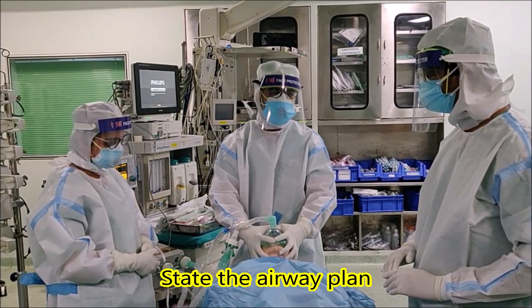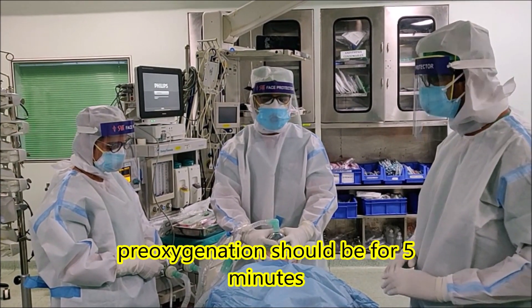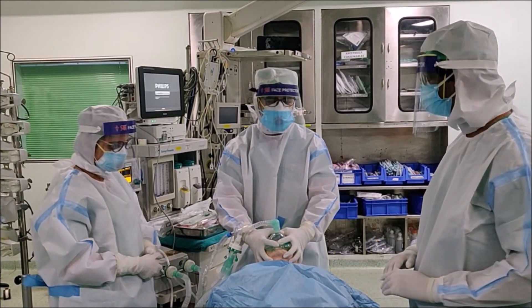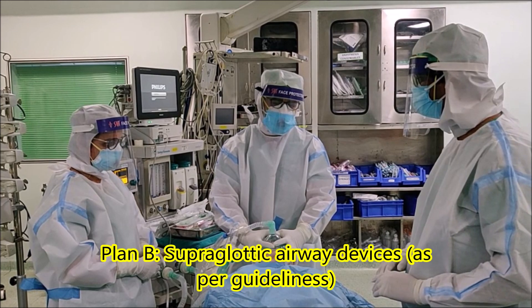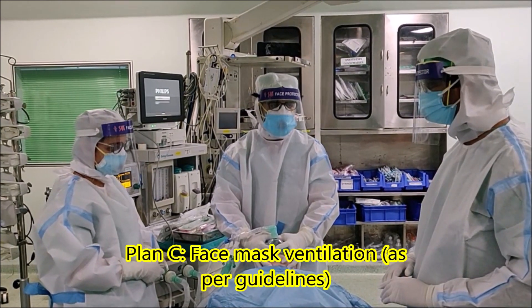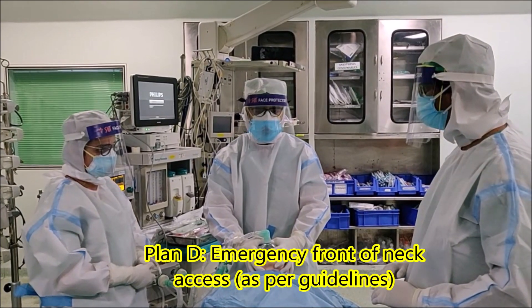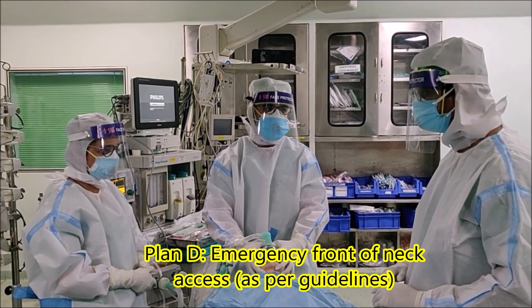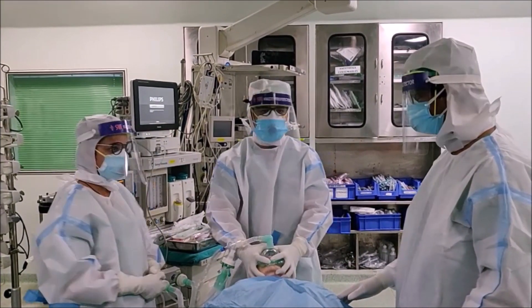Can you state the airway plan? The airway plan is a rapid sequence intubation with a video laryngoscope with a pre-loaded endotracheal tube with stilet. If that fails then we'll use a supraglottic airway device, and if that fails we will use low pressure mask ventilation with two-handed bag technique. If we can't bag we'll go for a front of neck access. Do you have the equipment available for this plan? Yes. Confirm end tidal oxygen more than 0.8? Yes.